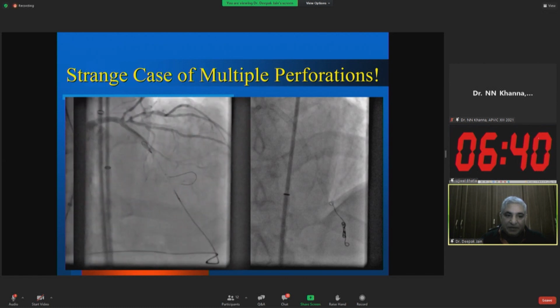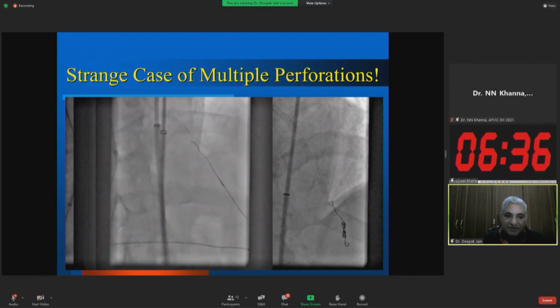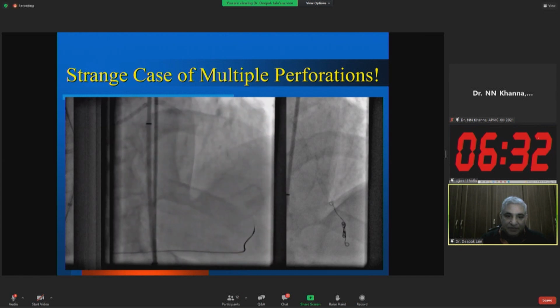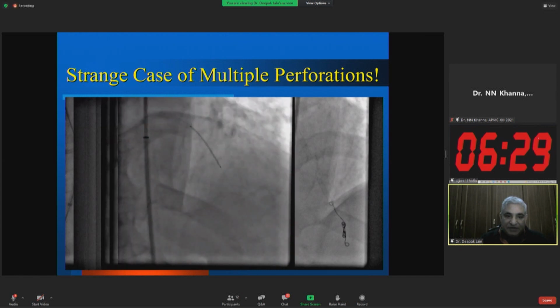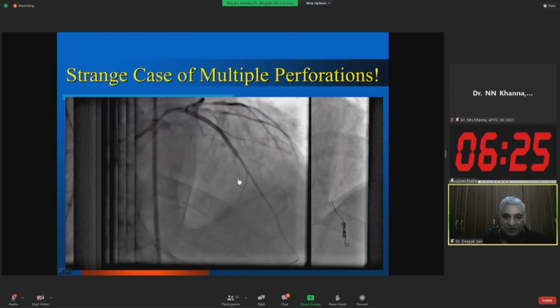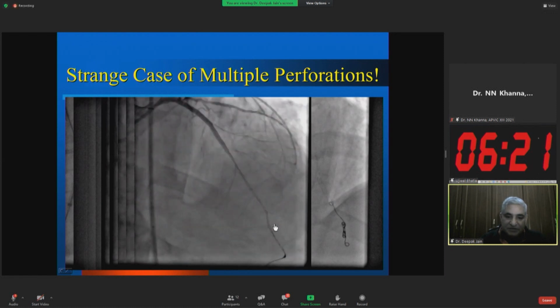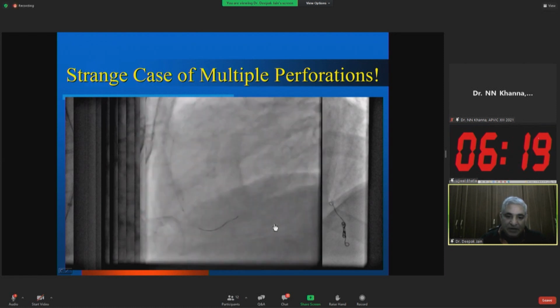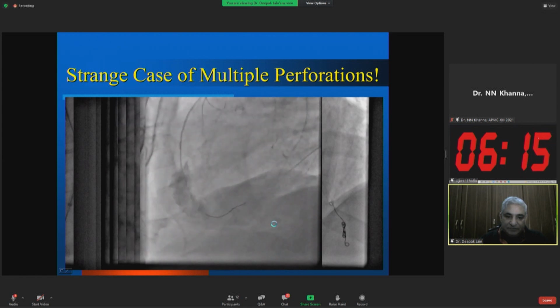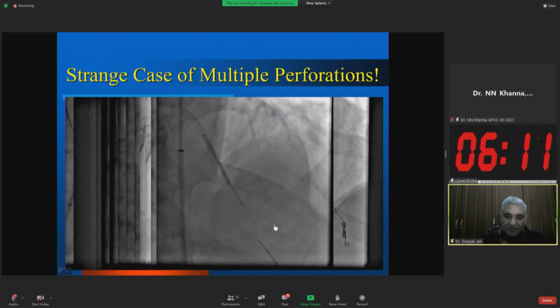Patient became unstable. There's some kind of haziness in the left main, so stenting of the left main first, and then externalization of the wire, balloon dilatation for preparation of the stent placement. So far, so good. But you can see here already perforation happening. This is where the microcatheter was all the time there. And with time, this perforation became massive. So coil occlusion there.